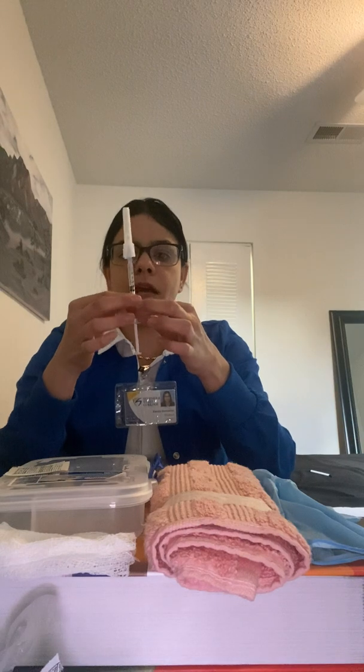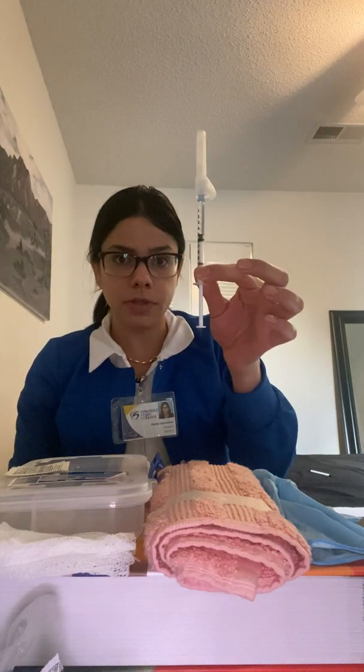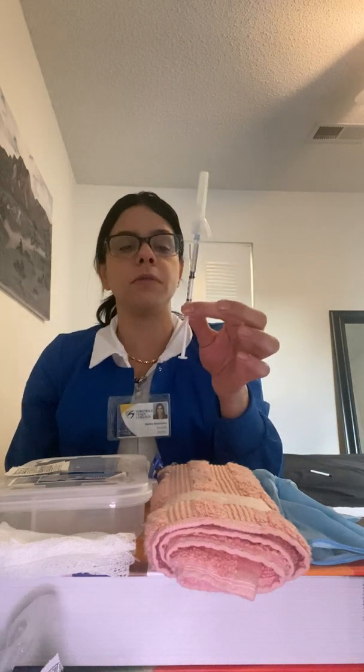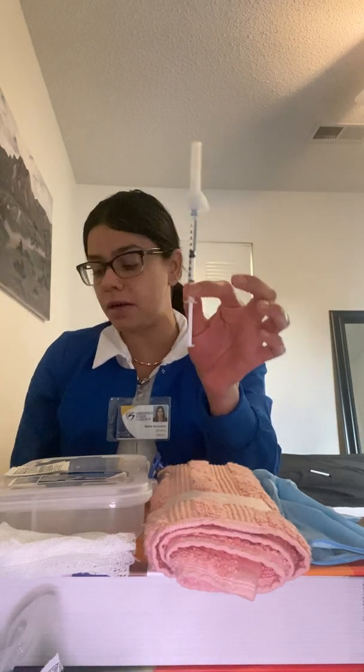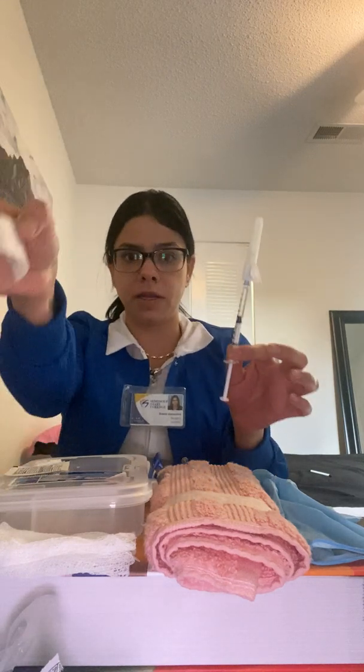Now that I have my medication, I have to label this medication with the patient's name, the medication, the amount, which is 0.5 ml, the date, the time, and the initials of the person that's doing it, which is me. I have my label here.